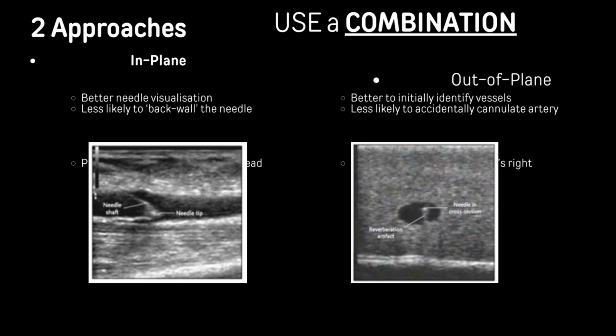So just the two approaches. Remember, there's the in-plane. Now, we don't use it that often. Sometimes it's difficult in the neck, especially when it's a short neck.